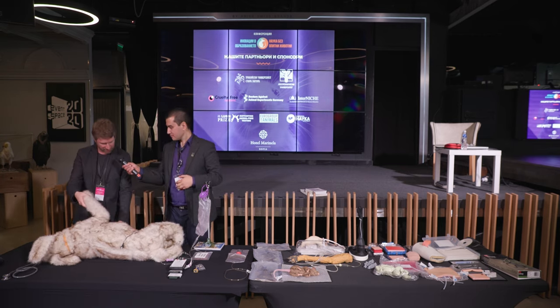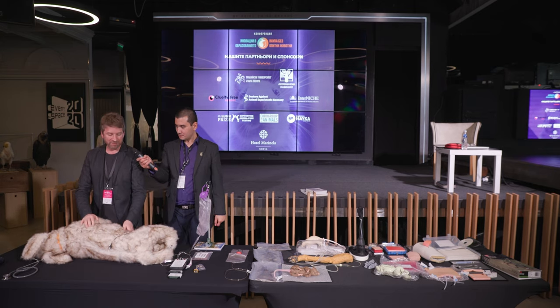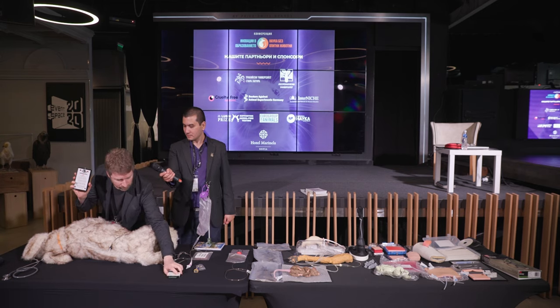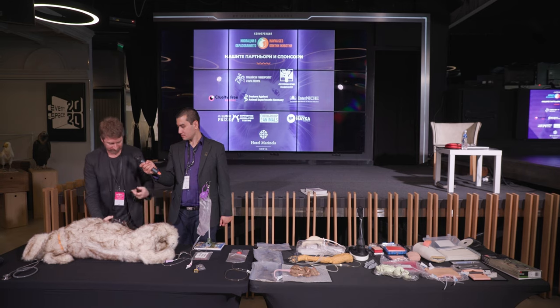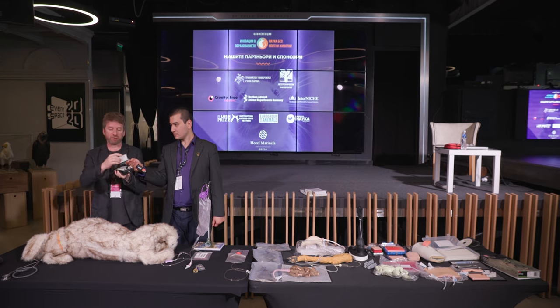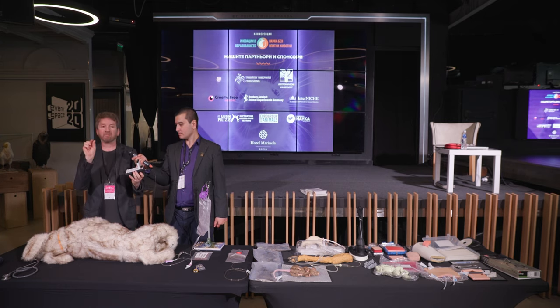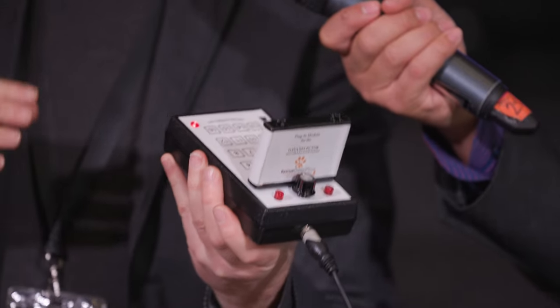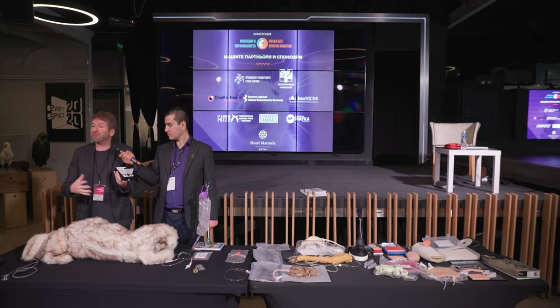Finally, we have the breath and heart sound simulator, which is something very important. This is the simulator itself, and we have two modules: one of breath sounds and one of heart sounds. We connect this up to Jerry — it's battery-powered. Within the chest and abdomen there are multiple small loudspeakers, and 14 different sounds that reflect different pathologies can be heard. This is something you wouldn't actually hear otherwise — it would take you 10 years to hear this with a range of patients.